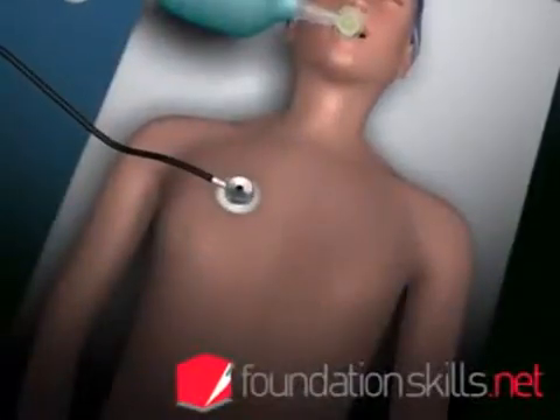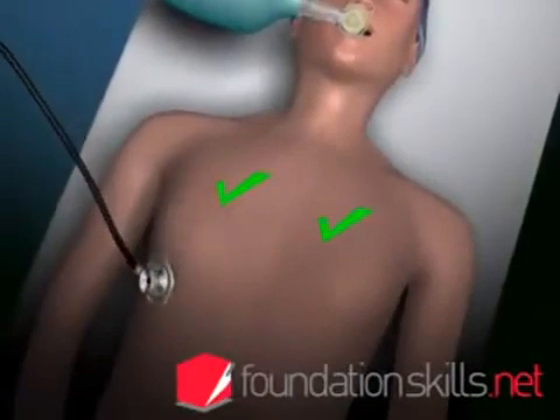Confirm the position of the tube by auscultating over the apices of the lungs, the axillae and the stomach.